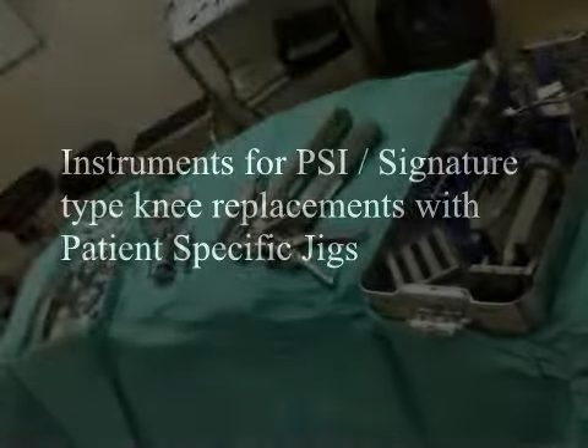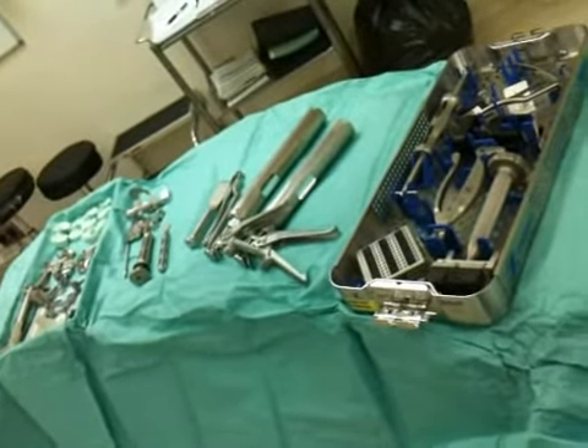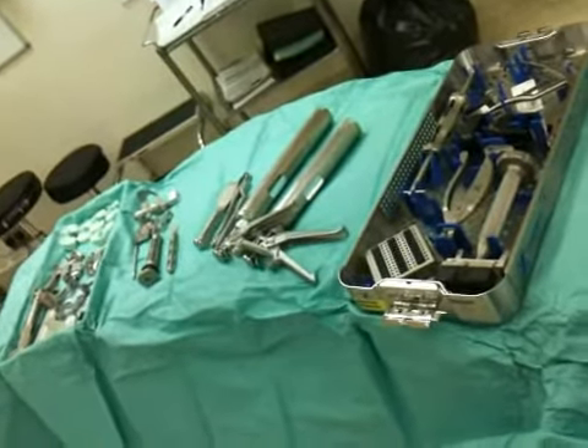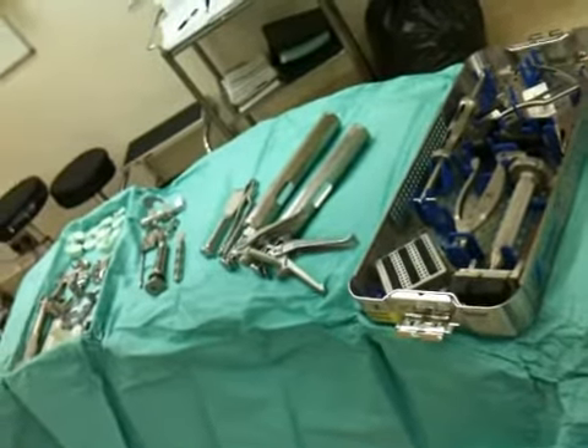As you can see, the number of instruments required for PSI instrumentation is quite small compared to what you would need for a manual knee replacement, because the instruments are patient specific.